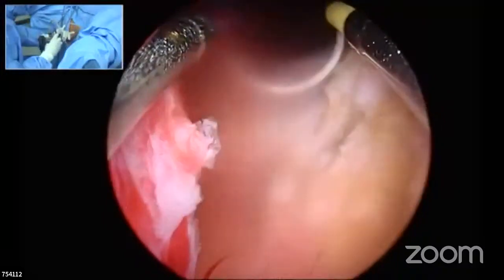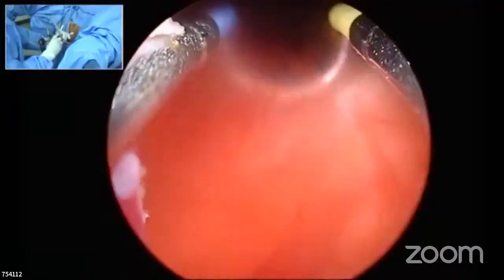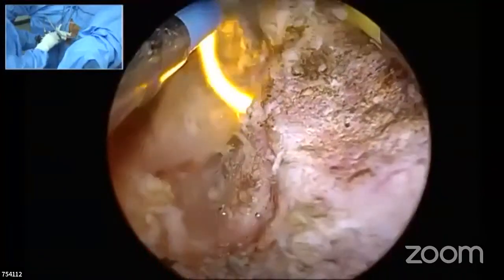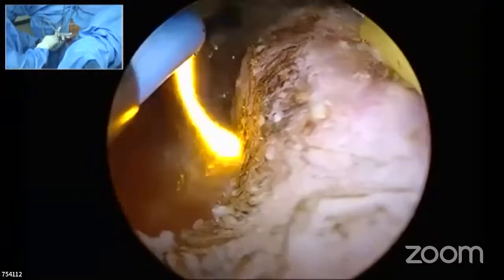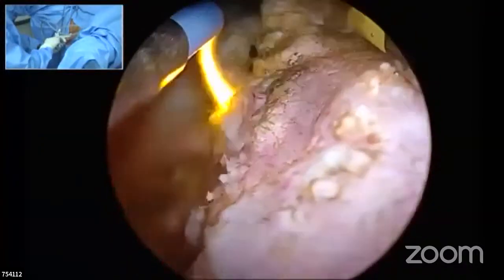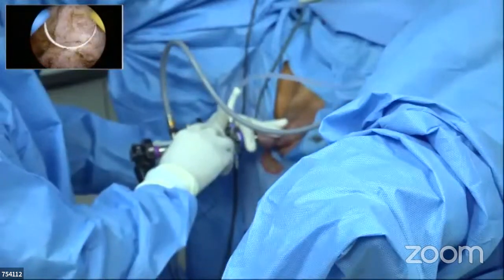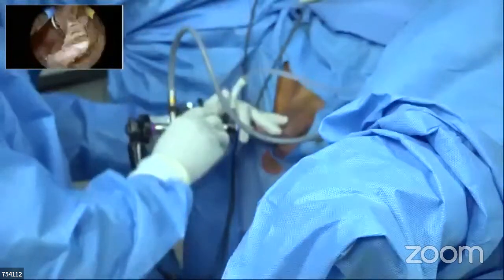So I have done a resection of this area. This is the way to cut. You keep your resectoscope fixed and you are moving only your thumb and your left hand. If you see my left hand, the passive element is going to be the right hand. The right hand has got only one movement. The actual boating and the loop movement is dictated by the left hand. The left hand will always tell how the loop is going to be moved in the tissue. The boat shape is coming because of the left hand movement, not the right hand movement. So never try to do this with the right hand, cutting and making both sideways movements by the right hand, it's going to be detrimental.